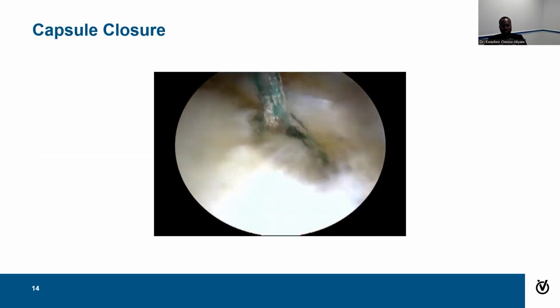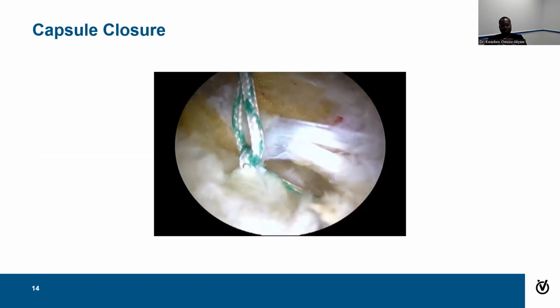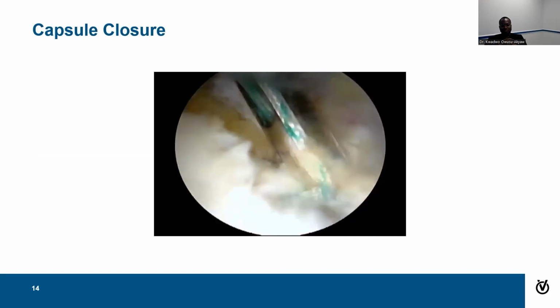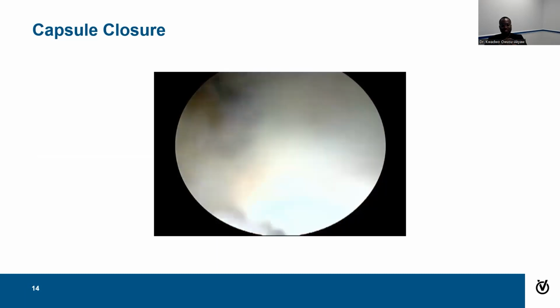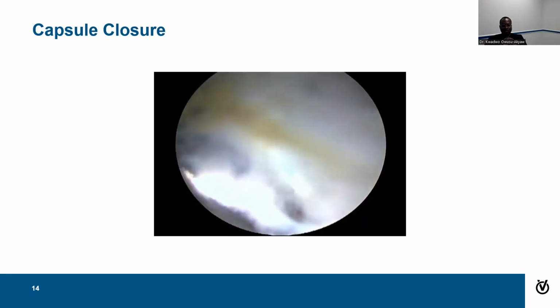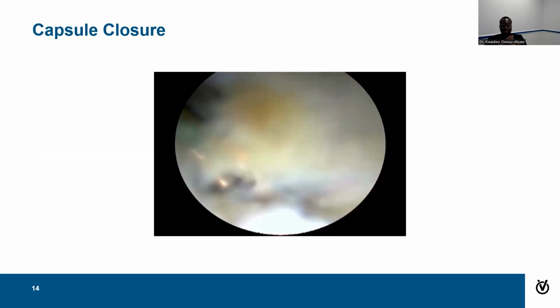Here it comes, there it is. The knot comes down, and then my metal knot pusher is coming in. I'm gonna push that knot down and secure that capsule closure. All right, and that usually takes anywhere from 3 to 5, or sometimes 6 or 7 stitches, depending on the situation, on how big we have to open the capsule or how much the patient needs.